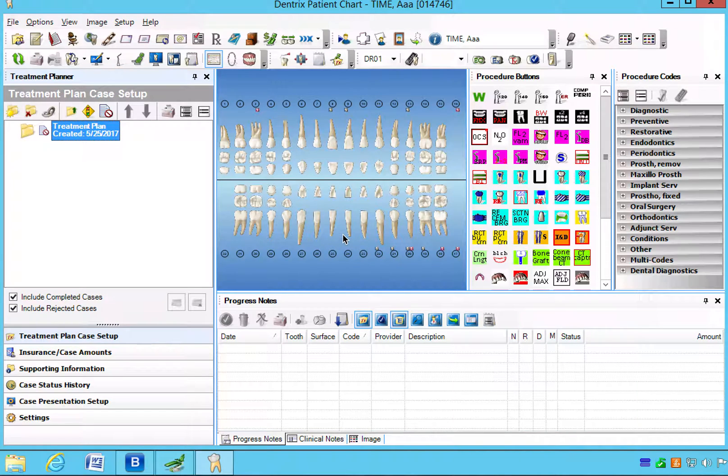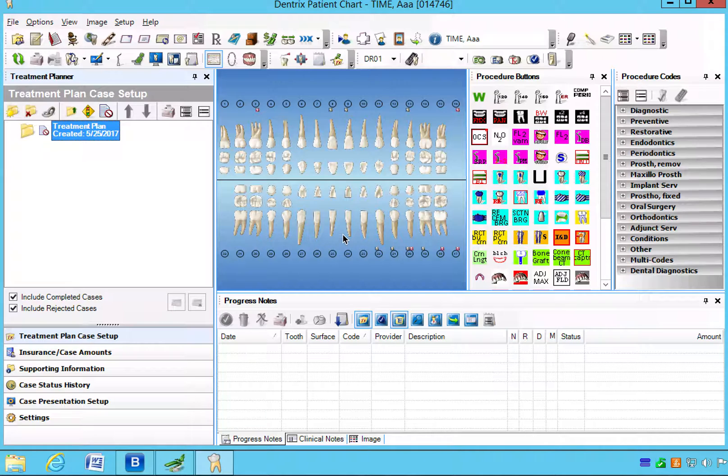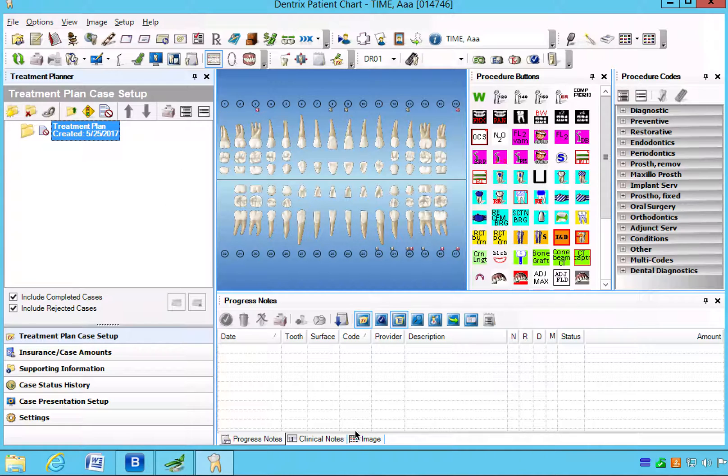Today we're going to talk about the Dentrix treatment planner layout and what we use this for is creating treatment plans while we're in the operatory so that the treatment coordinator can have the information she needs to present the treatment to the patient.